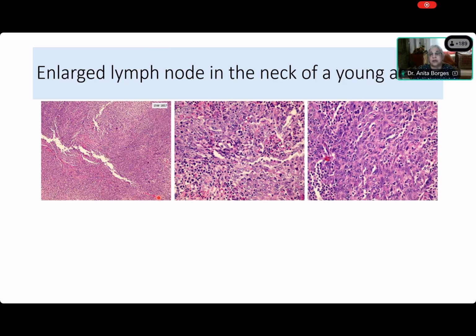I'm giving you a system, Aishwarya. So come on. People are seeing differentiation over here. We are being on the chat box. They're calling something Hodgkin and all sorts.